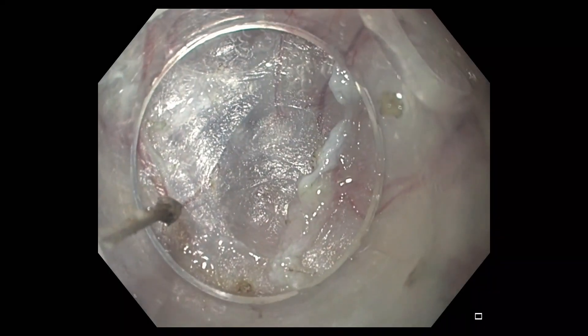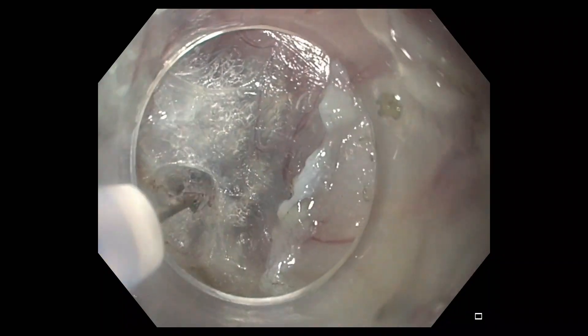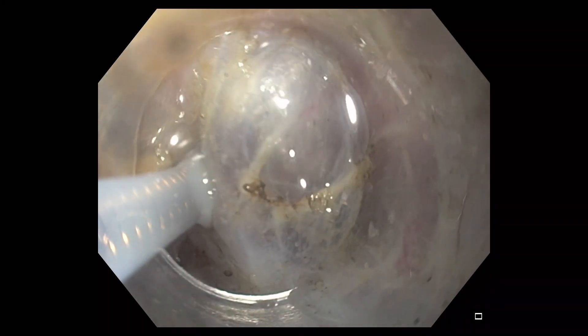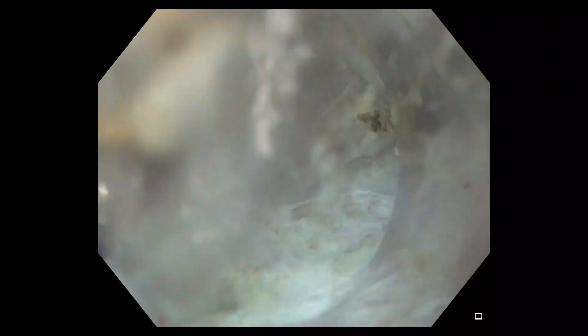The triangle tip J then allows precise dissection of submucosal fibers in the submucosal muscular plane for the creation of a submucosal tunnel. When the submucosal dissection plane becomes difficult to visualize, the triangle tip can be retracted and the catheter advanced to contact the submucosa.